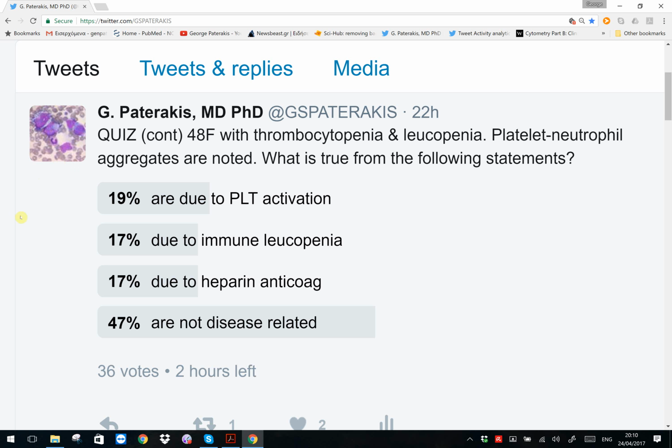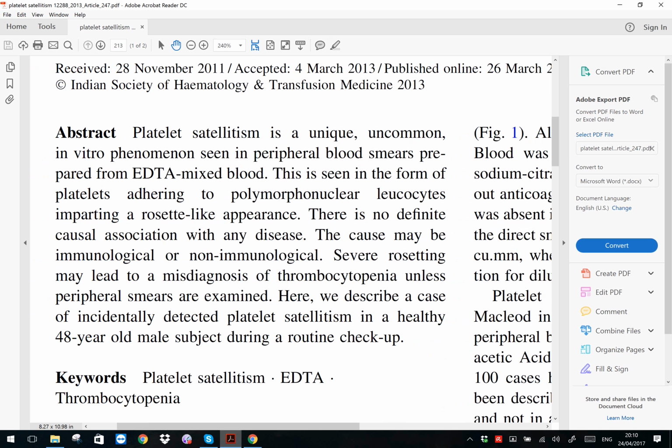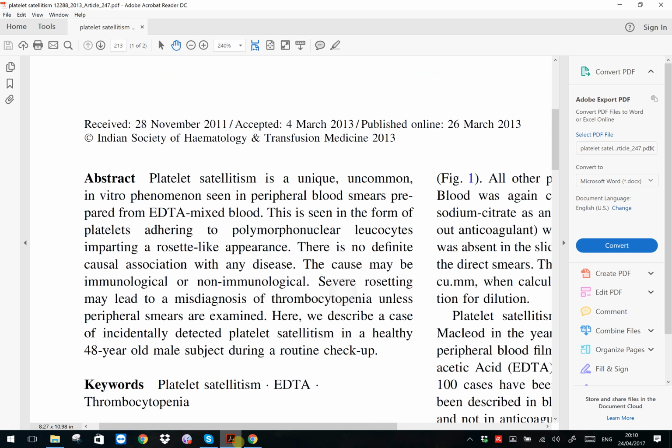This phenomenon is called platelet satellitism. Platelet satellitism is a rare and interesting in vitro phenomenon. It's a unique and uncommon in vitro phenomenon seen in peripheral blood prepared from EDTA mixed blood. It is seen in the form of platelets adhering to polymorphonuclear neutrophils.